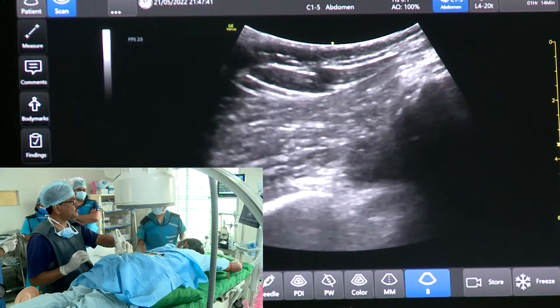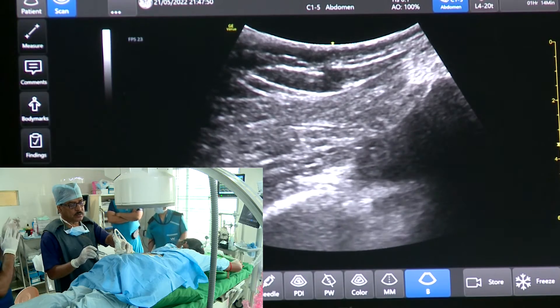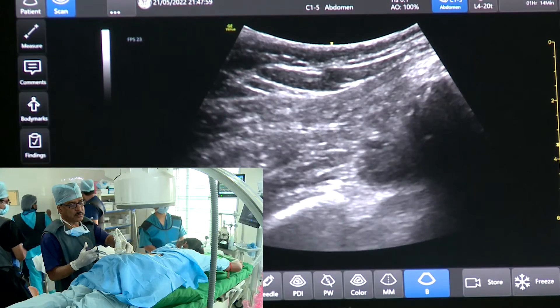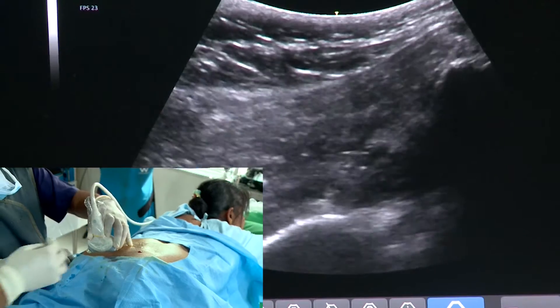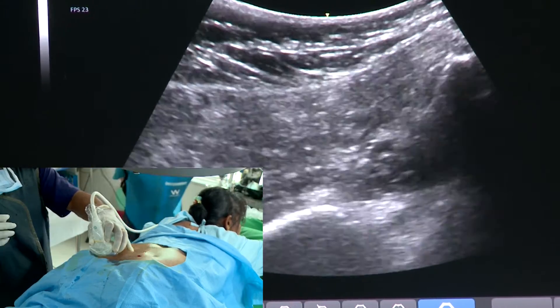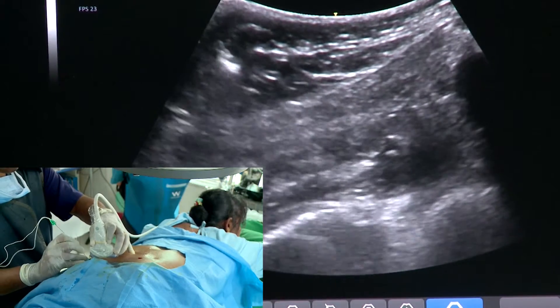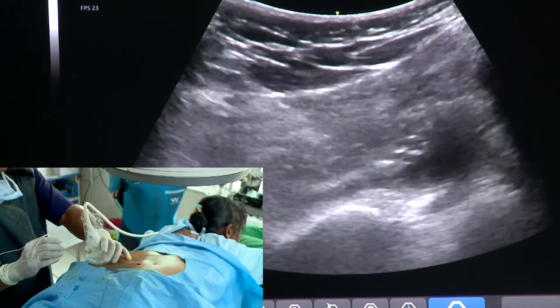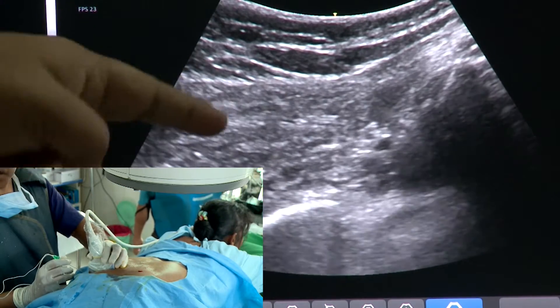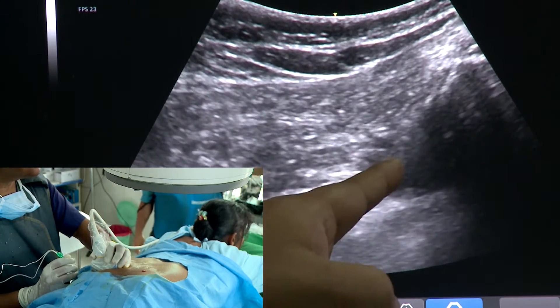You can see how you are holding the probe. Below the hyperechoic area is where we are starting now. The gluteus maximus is punctured — this lower muscle. There are two muscles here, and you can see the movement of this lower muscle, the lowermost one.